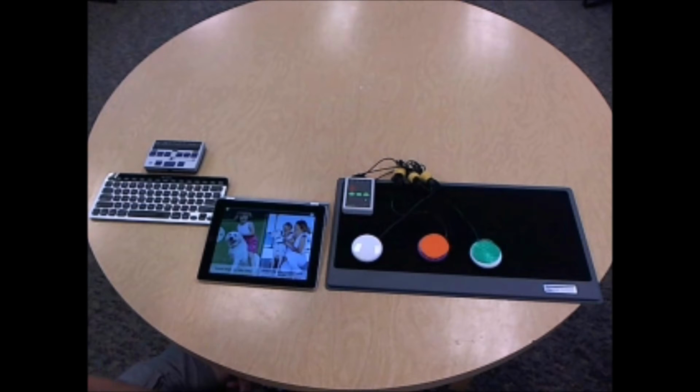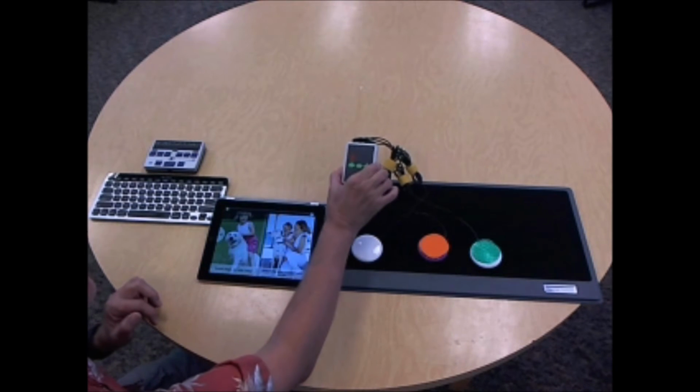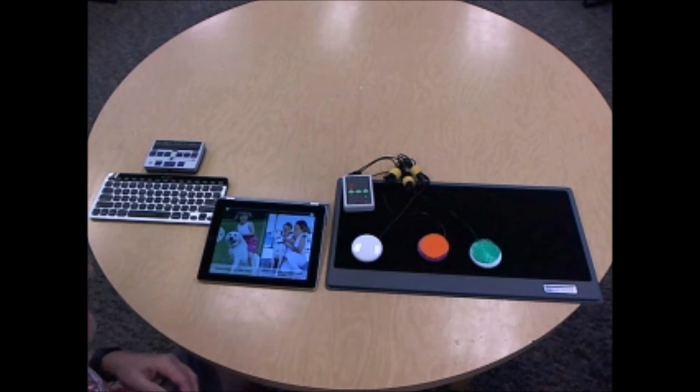I'm an assistive technology specialist at the Washington State School for the Blind. Today I'm going to demonstrate this device that's called Switch2Scan. It's sold in the United States by Inclusive TLC and it's made by Praetorian. What's really neat about this device is it has a voiceover option and it also has a switch option.